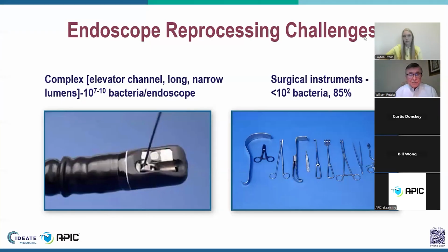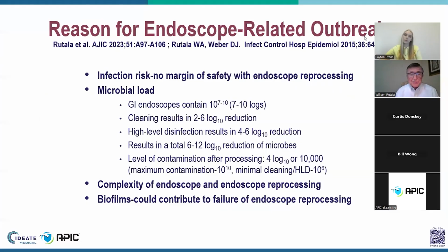On the next slide, we again see an expansion of that. We can see in that slide the microbial load. Microbial load is 10 to the 7th to 10 to the 10th. That's 7 to 10 logs. Now, what the literature shows is that when you clean, you essentially reduce anywhere from 2 to 6 logs.